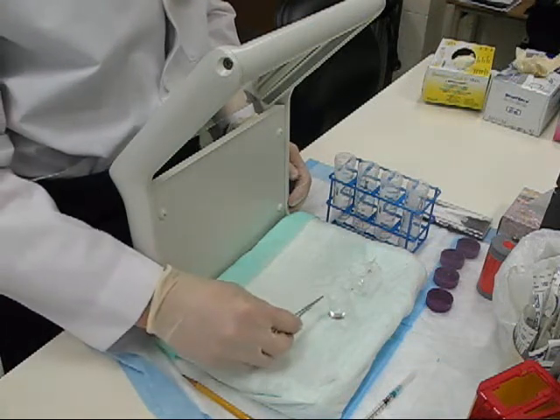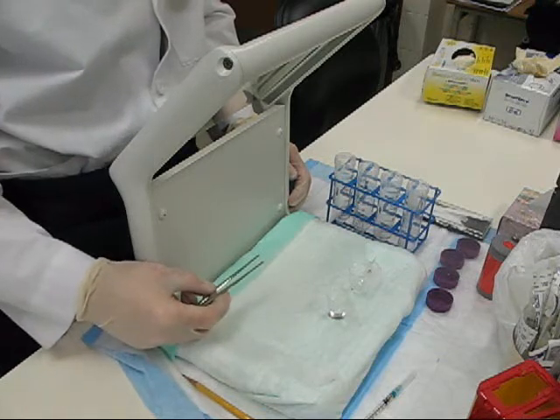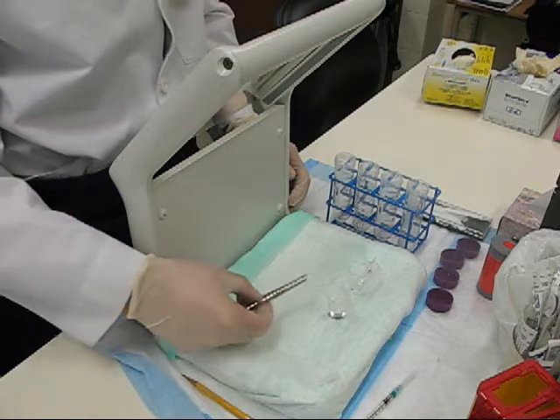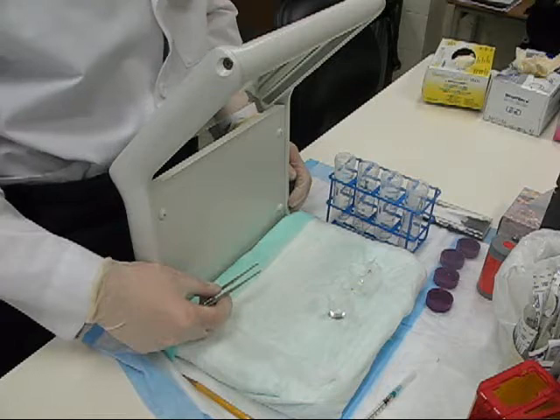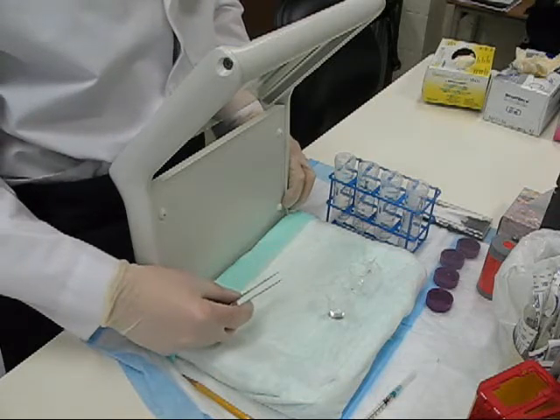Watch the solvent front slide up the ITLC strip. Be sure to pull it before the solvent front reaches the top of the ITLC strip. It's difficult to see, so pay attention to it closely.